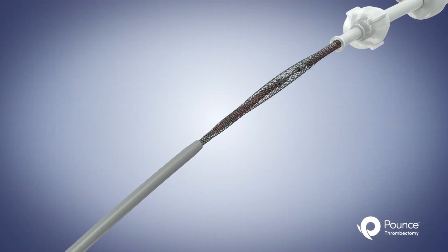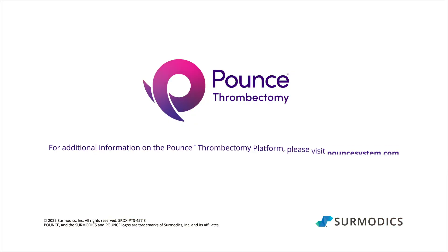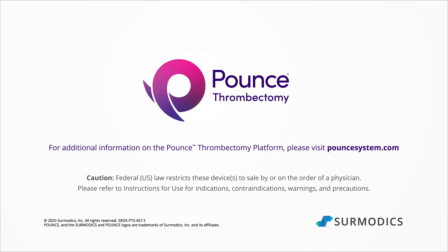The Pounce system is then removed from the body. The Pounce Thrombectomy System strikes quickly to capture clot.